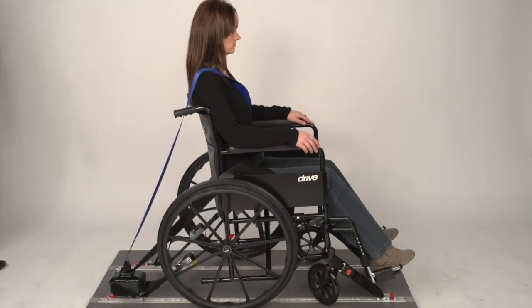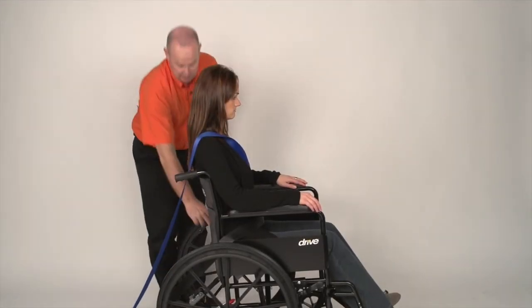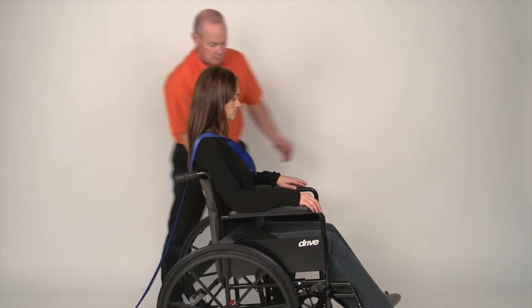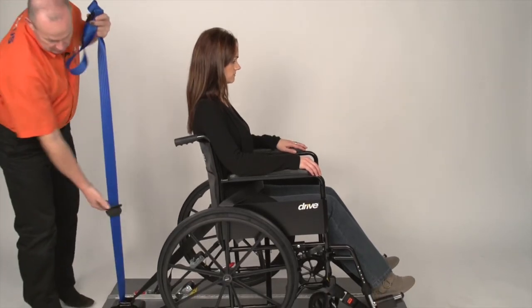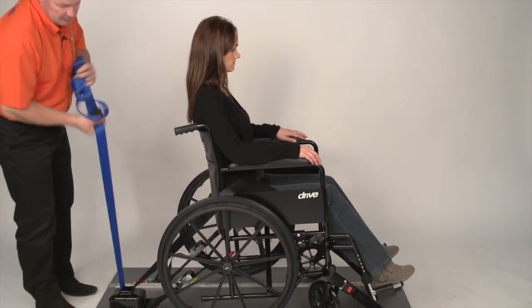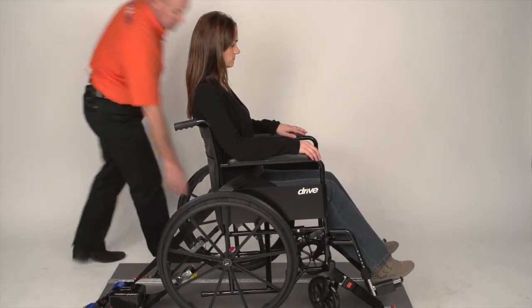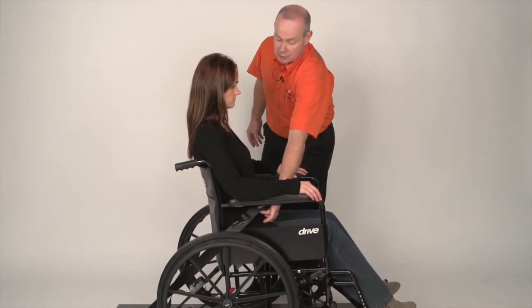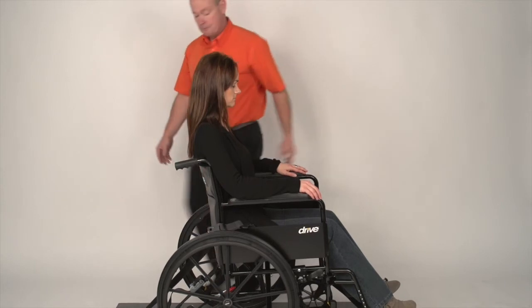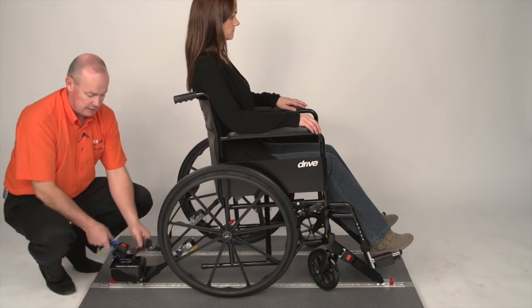That's how to secure the person in the wheelchair. When it comes to taking the passenger harness off, do it in reverse. Start with the blue — release the tongue from the buckle, come underneath, remove the clunk clip and gently put the webbing back into the reel. Come to the black, come underneath the armrest, come as low as you can to the body and just let it go. Come from behind, retrieve and always put them back together.